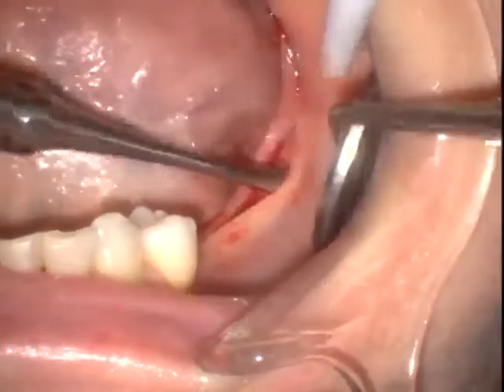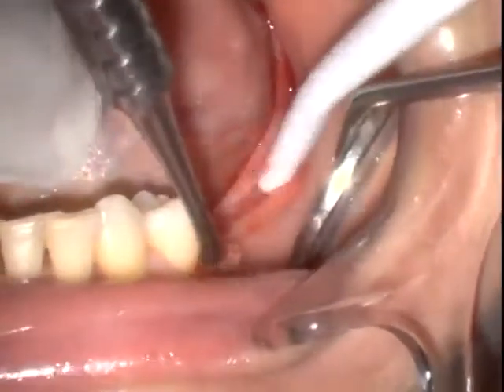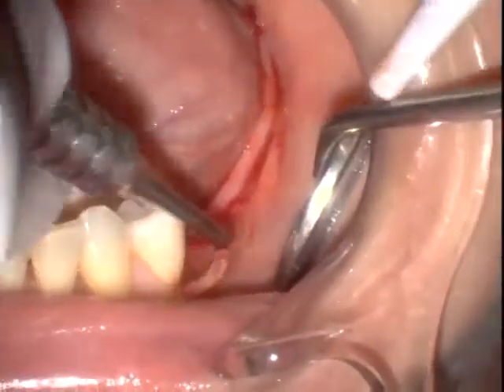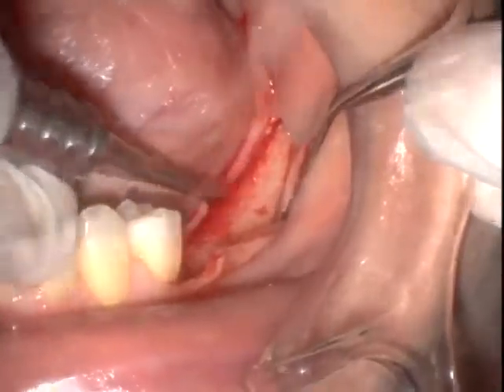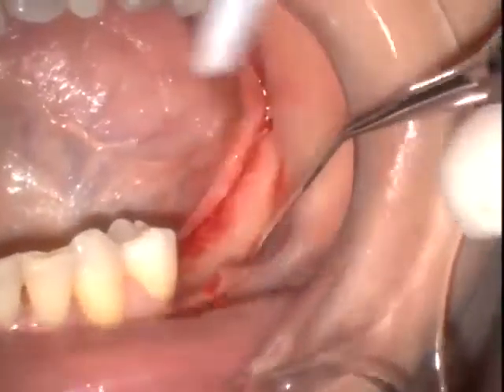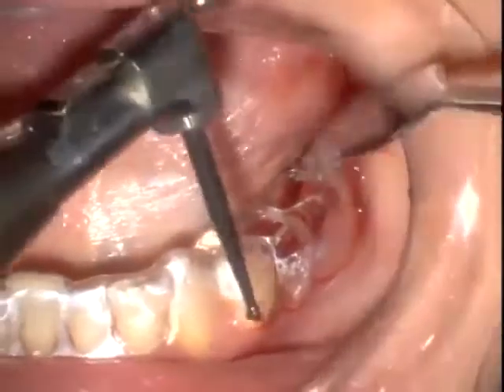Lingual crestal incisions are utilized to the ramus, and then we do a sulcular approach just distal to the second bicuspid. A microperiosteal elevator is utilized to reflect the flap and expose the underlying osseous anatomy. And here we're utilizing Devimed instrumentation from their periodontal kit, and we're exposing the bone, and you can see the accuracy of what we saw in the cone beam image.